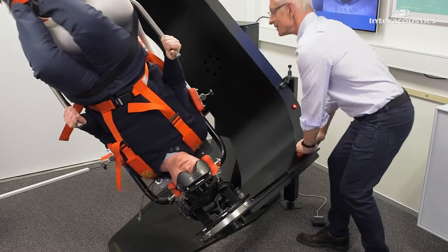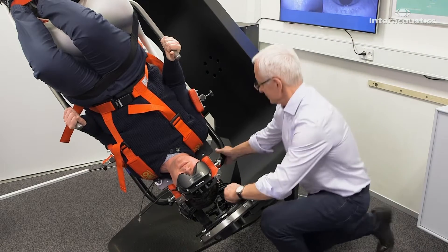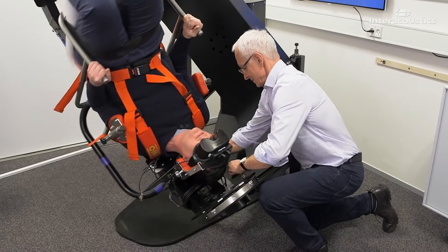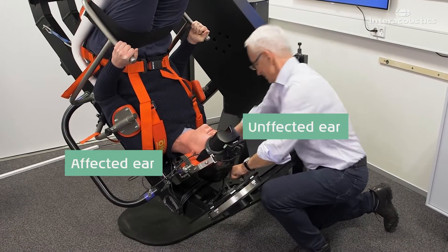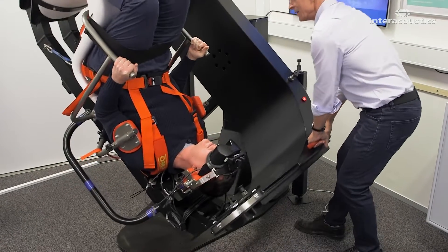To bring the patient into the next position, lock the main arm using the foot switch. Release the plunger and rotate the secondary arm 45 degrees over the unaffected ear of the patient. Apply 12 rapid decelerations.